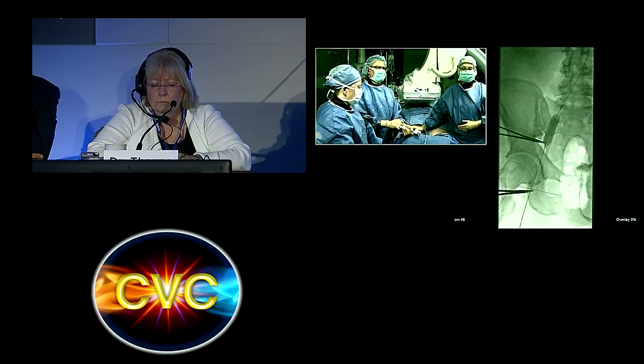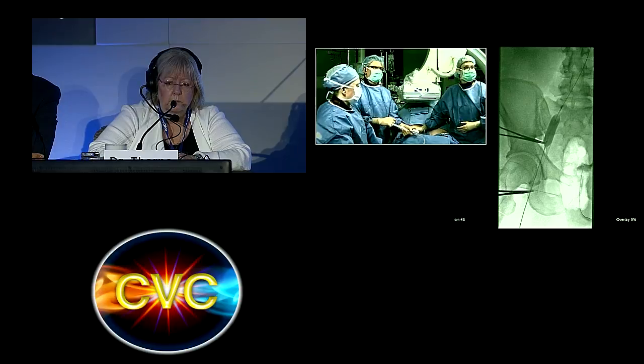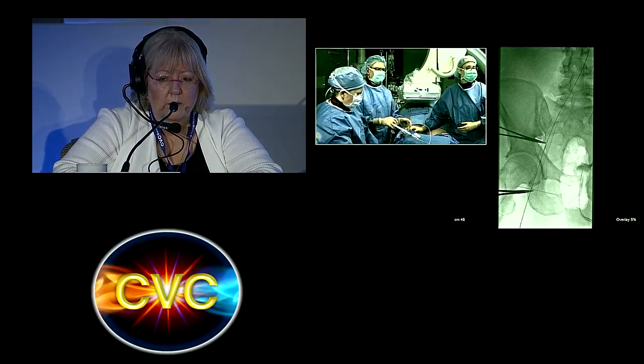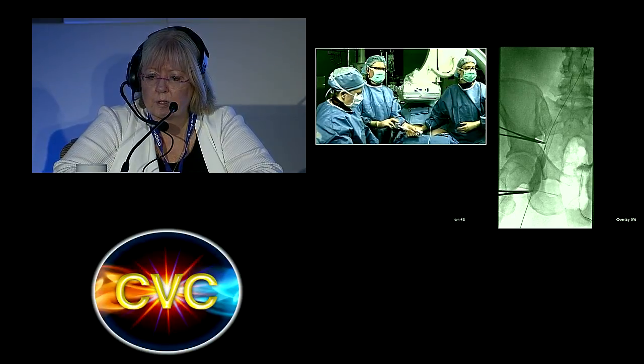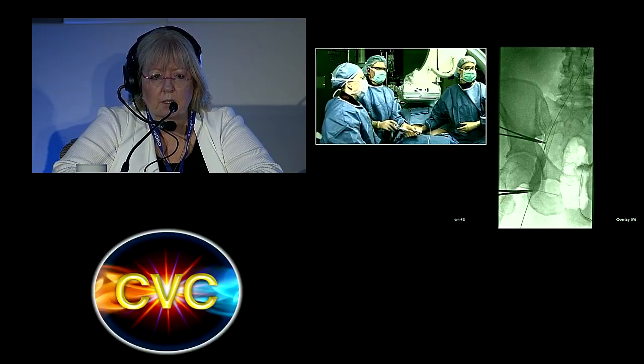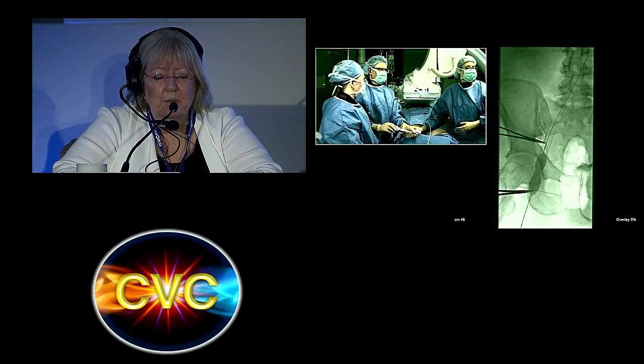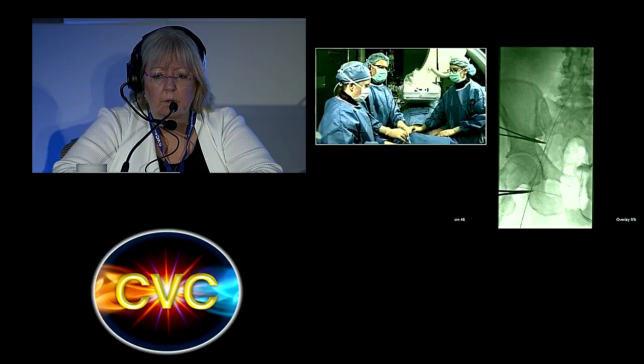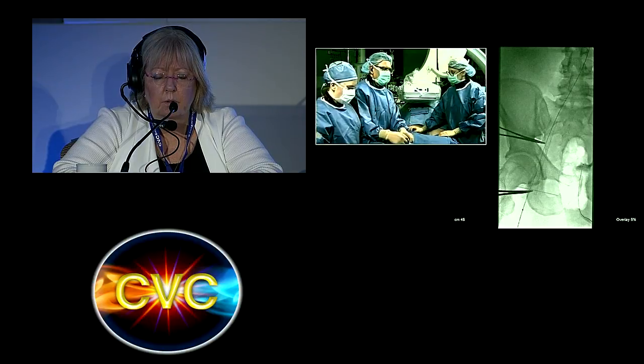Do you do some timings on your ballooning, just like we do on the arteries? Any preference of timing that you inflate the balloon in a chronic DVT like this? I usually use 30 seconds, and I cheat a lot. I mean, you don't have a high pressure balloon. I'd just like to inflate it maximally, though. Yeah. All right, I think that the end of the stent finished pretty much where our marker was.